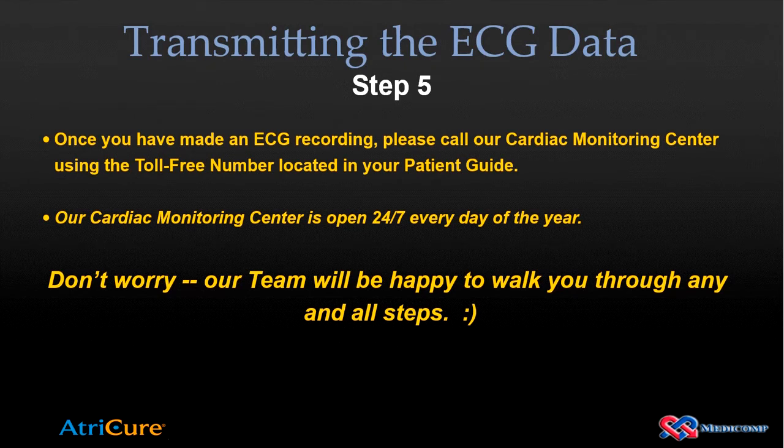Now we can move on to the transmission steps of this segment. The call-in sequence was detailed previously, so we will be describing just the transmission steps. When you are training the patient, you will call into the monitoring center. Remove the monitor from the belt clip. It is not necessary to remove the fingertip accessory, although the technician may direct you to do this.